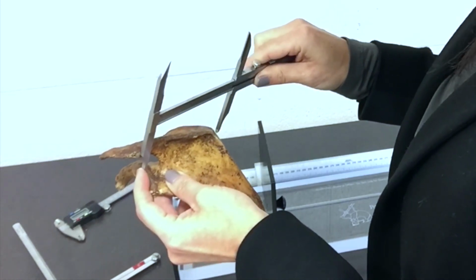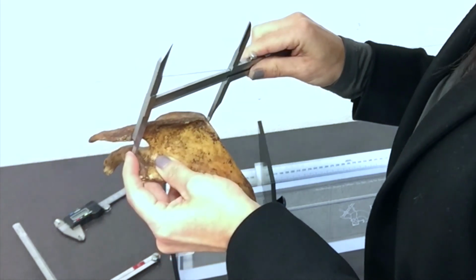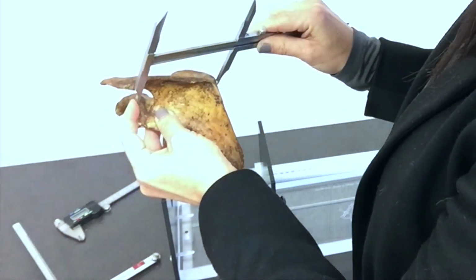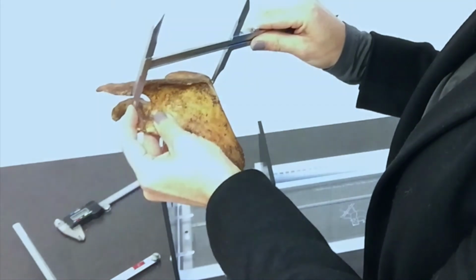The fixed point of the caliper will go there on the glenoid fossa, and then take the movable end and bring it to the medial border of the scapula, just along the level of the scapular spine.